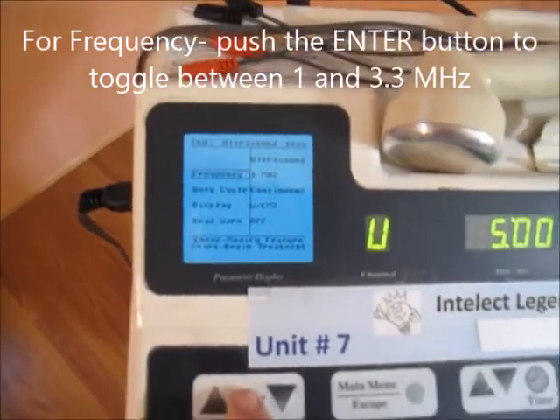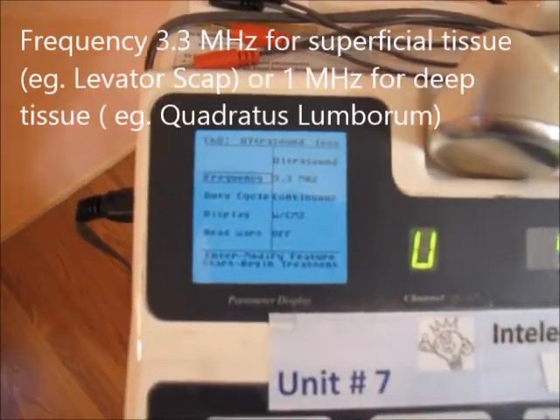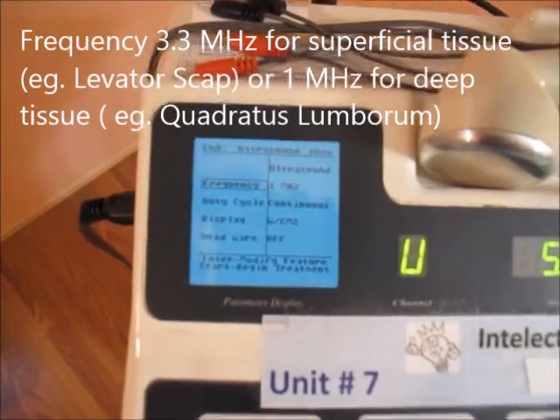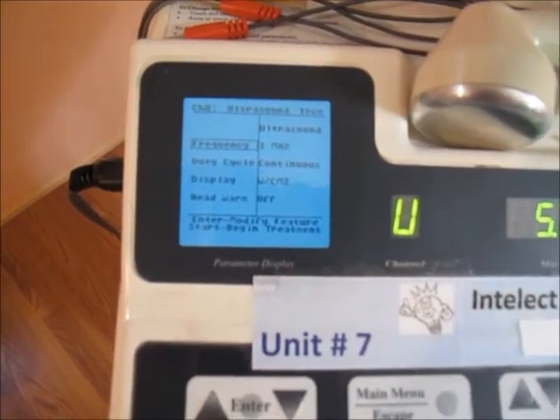Under frequency, select enter. Go to 3.3 MHz if you have a superficial tissue, or go to 1 MHz if you have a deeper tissue. The way I changed that was by pushing on this enter button right here, which toggles back and forth.